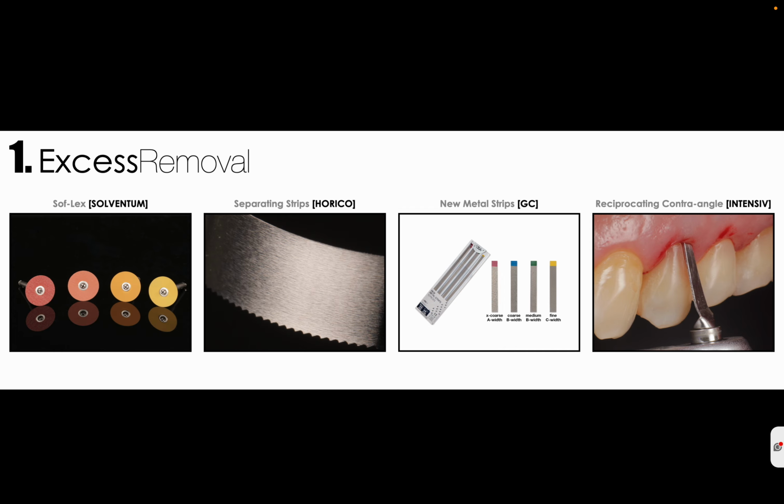But this part is important: do it slowly and without reaching the gingiva. Also, if you need, you can pass these metallic non-serrated strips just to break and polish and remove all the excess.